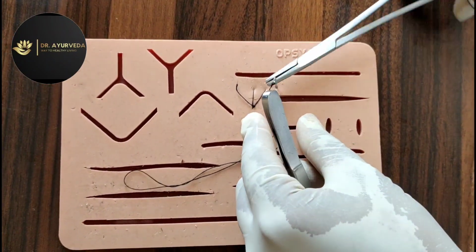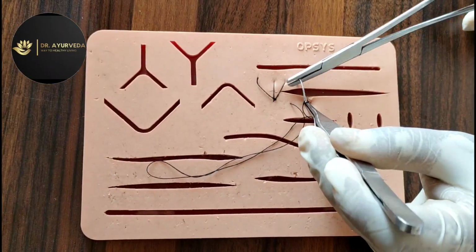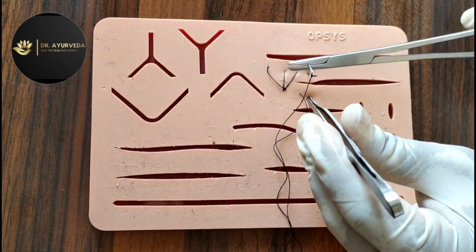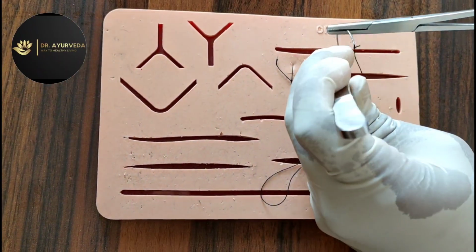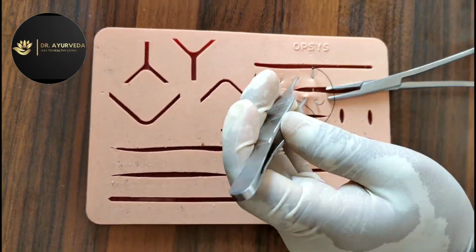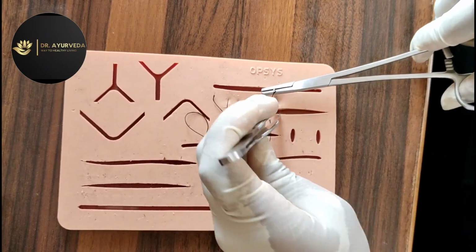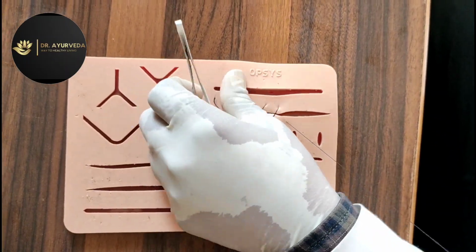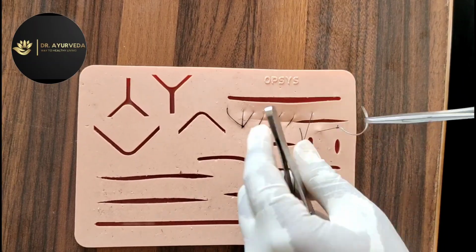If a wound is longer, then it can be easily closed by simple interrupted or interrupted horizontal mattress sutures. A continuous suture technique can be used to perform the closure efficiently. The most frequently used continuous suture technique is the non-locked suture technique. In this technique, the distance between the stitches is about 1 to 1.5 cm.